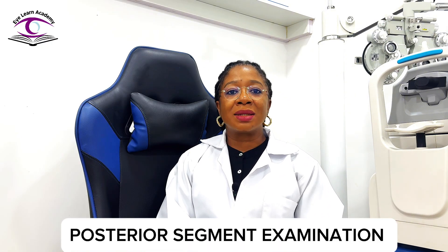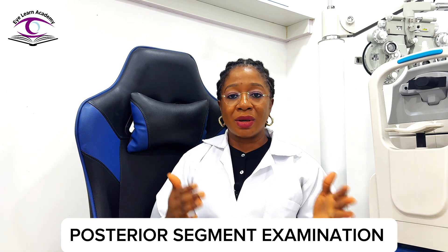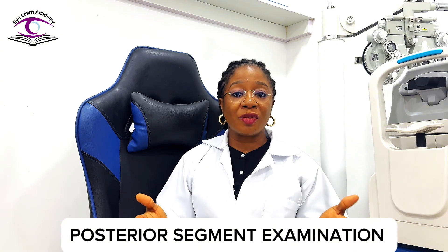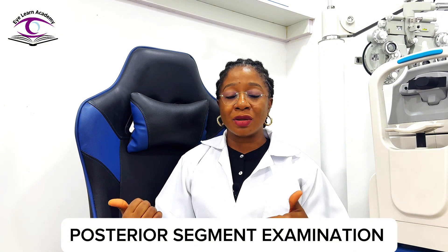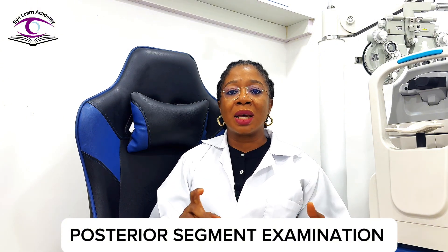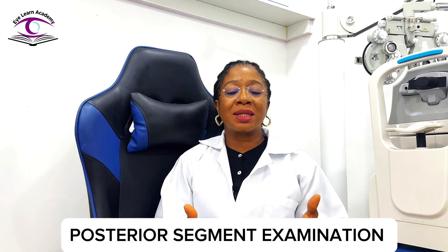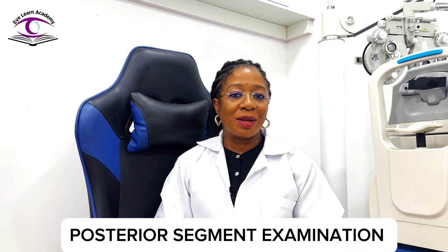When you see the red reflex, you then observe the anterior segment. So the routine when performing ophthalmoscopy is: first observe the red reflex, then the anterior segment, then the posterior segment, where you look at the disc, the blood vessels, and lastly, the macula.